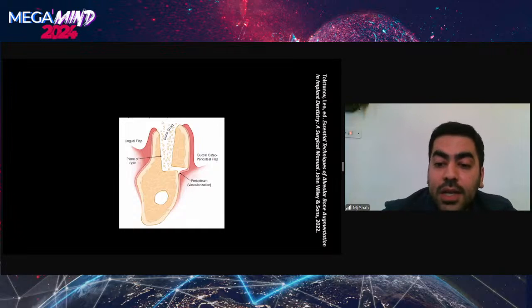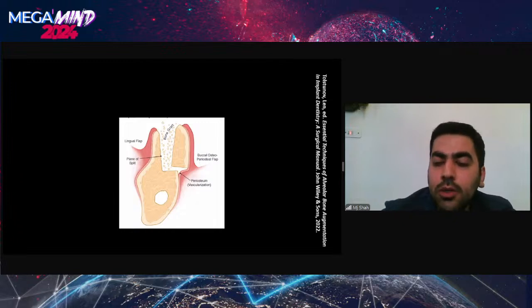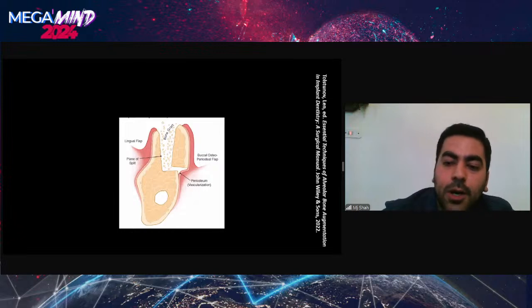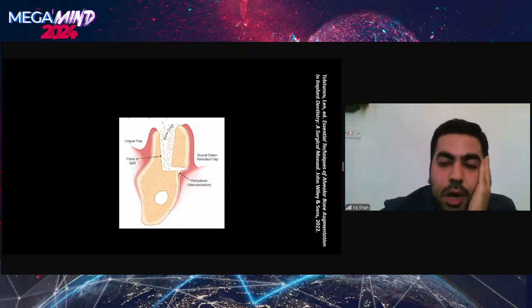Because of the high density of the bone. A split expansion is done in stage 2 after corticotomy is done in stage 1. And afterward, a particulate grafting material is inserted as an interpositional inlay graft in the space between the cortical bony plates. I will explain more about this in the upcoming slides.